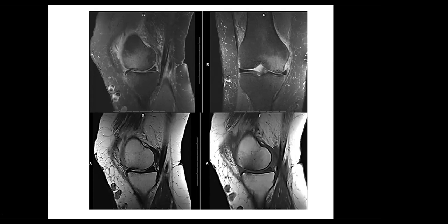Okay, we have about 10 seconds left. Are you finished? Yes, it's a subchondral bony defect, osteochondritis dissecans, stage 2. Okay, further management? I think for further management, I refer to the doctor for medical treatment.